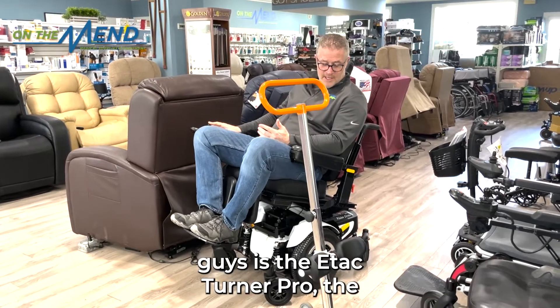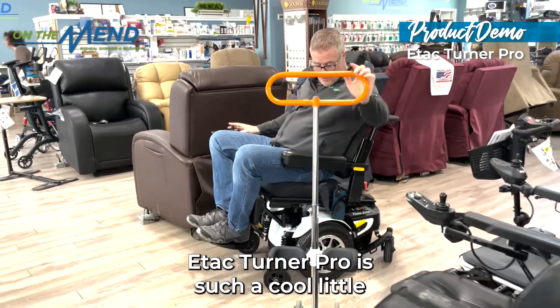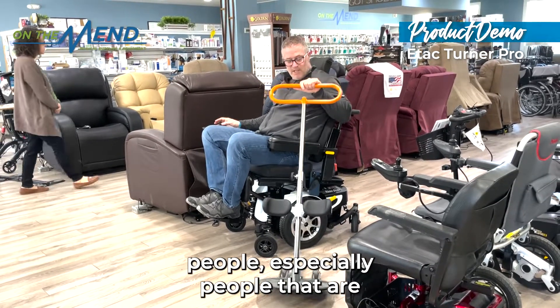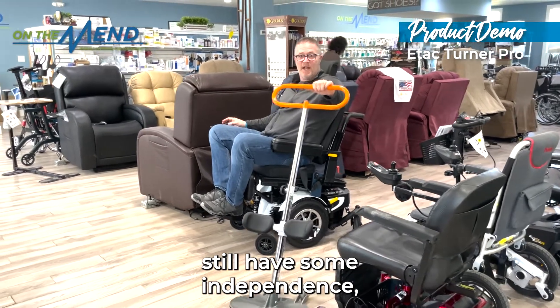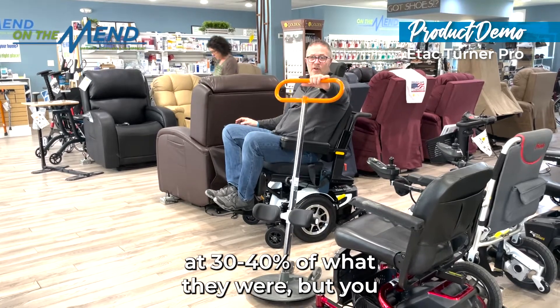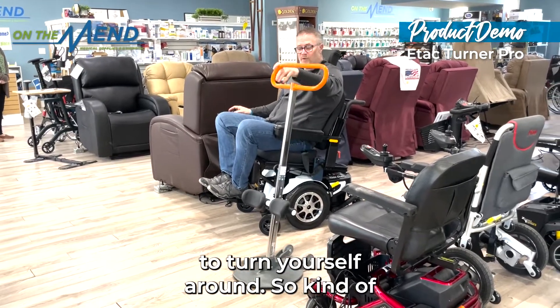The other thing I want to show you guys is the E-Tac Turner Pro. The E-Tac Turner Pro is such a cool little device. It's a device that can be used to help people, especially people that are not yet fully dependent — you still have some independence. Maybe your legs are only working at 30–40% of what they were, but you need something to get up and turn yourself around.